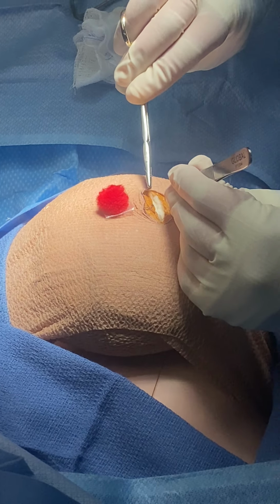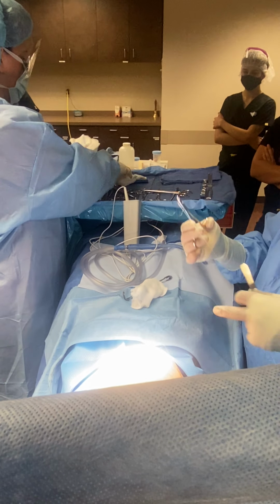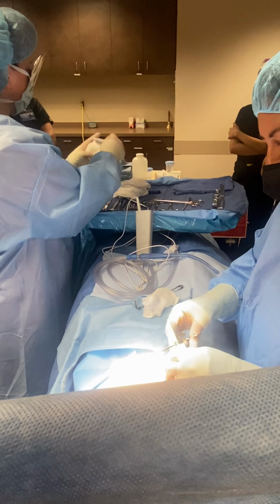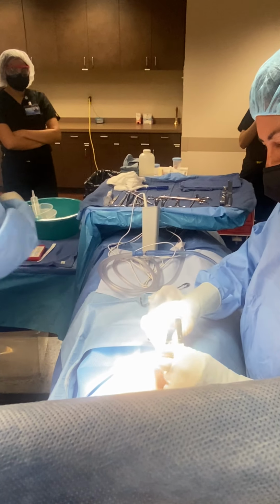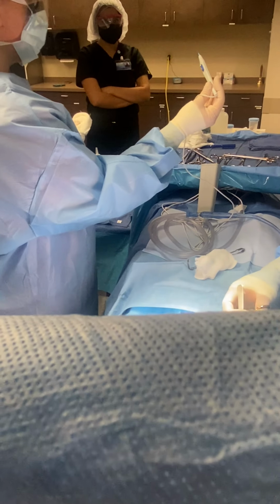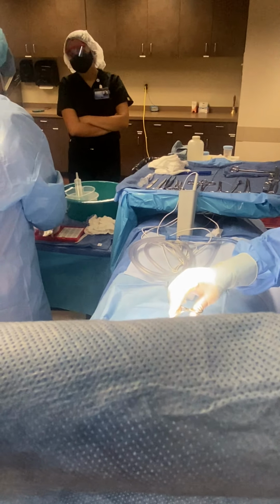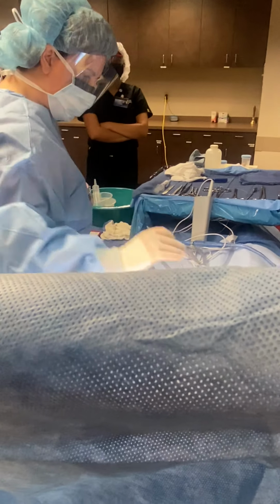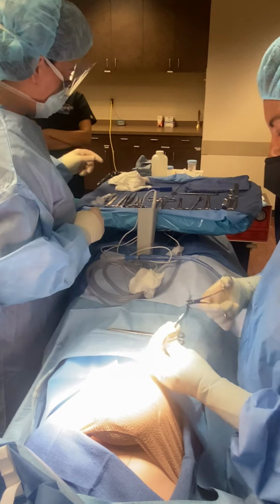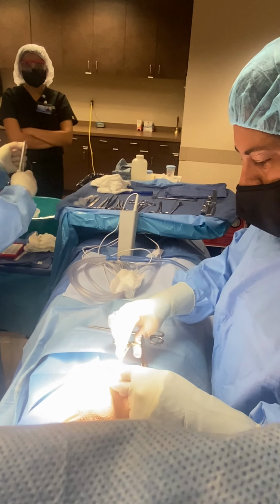Okay, I think I need to count one more time. Raytex. One. And two, three, four, five, six, seven. Oh, wait, no. Let's start that over. One, she has there. Two, three, four, 6, 7, 8, 9, and 10. Perfect. Laps. 1, 2, 3, 4, 5. Bovie tip, I have one here. One Bovie. Blades. I have one up on the mayo. 2, 3, and 4. Four. And hypodermic needles, I have one. Two. And what else? Stitches. One working. One little fishy right here. So one working, two, and then three.